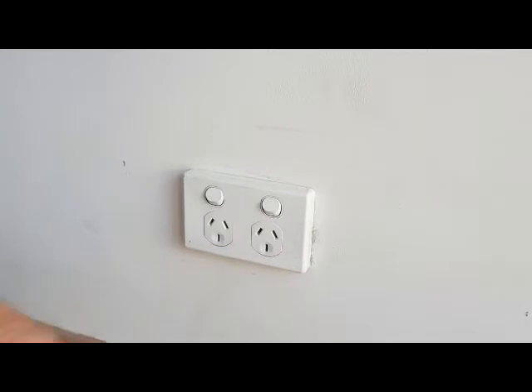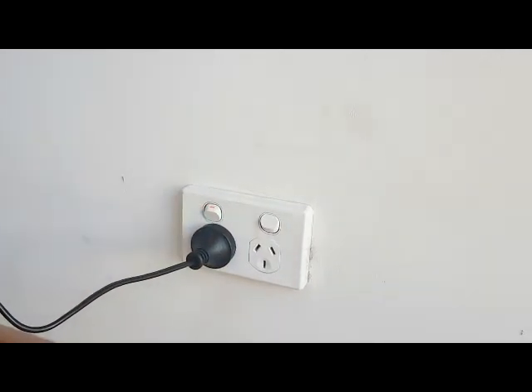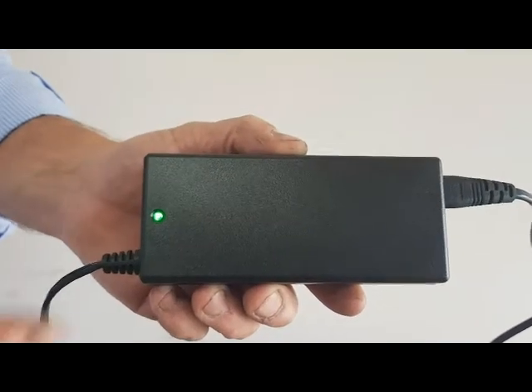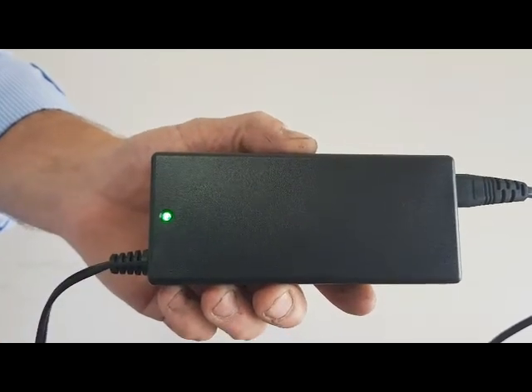Please now watch us demonstrate. Take the charger and plug it into the wall and turn it on. The charger will now have a green light showing. Please check that the green light is showing — this will confirm that the charger is on.